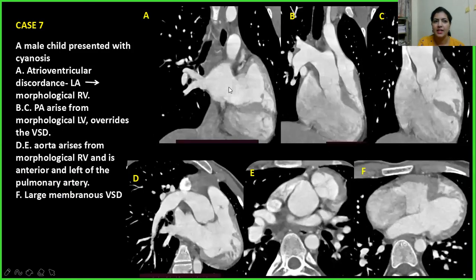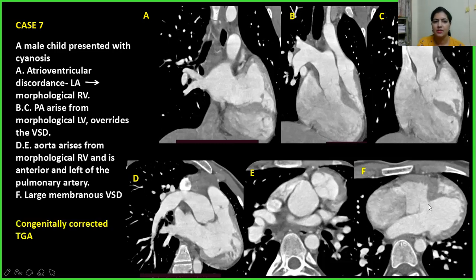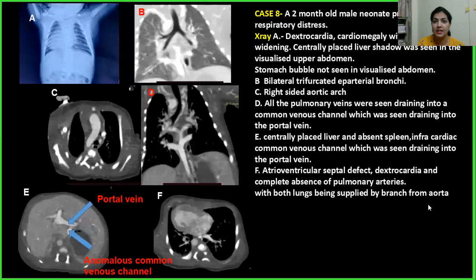Case 7: A male child presented with cyanosis. Pulmonary veins draining into the left atrium, which was opening into the morphological right ventricle. The pulmonary artery arising from the morphological left ventricle overrides the VSD. The aorta originates from the morphological right ventricle and is anterior, superior, and left to the pulmonary artery, with a large membranous VSD. This was a case of congenitally corrected TGA.